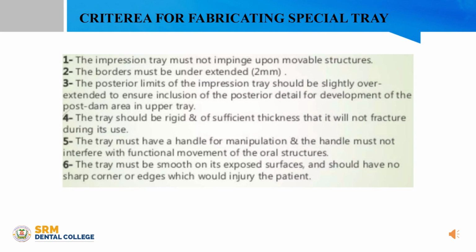The tray should be rigid and of sufficient thickness that it will not fracture during its use. The tray must have a handle for manipulation and the handle must not interfere with the functional movement of the oral structure. The tray must be smooth on its exposed surfaces and should have no sharp corner or edges which could injure the patient.